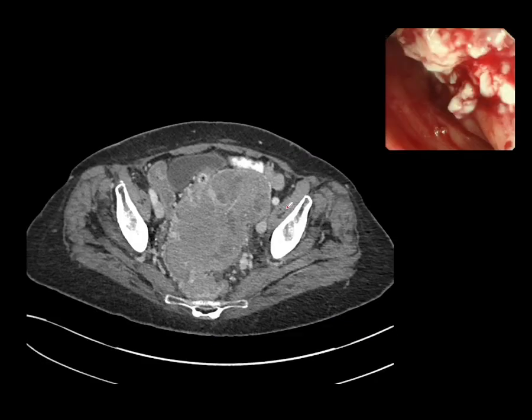And here's the CT on this patient. I actually thought this might be a primary bowel tumour when I saw the CT scan, but in actual fact the patient underwent endoscopy, and you can see it was a primary ovarian malignancy which was actually growing through the wall of the bowel here, as you can see on colonoscopy.